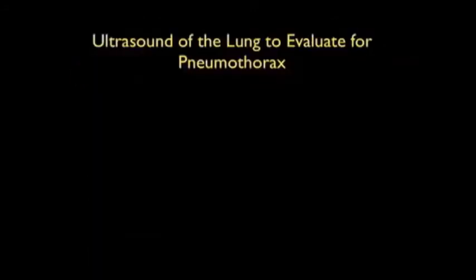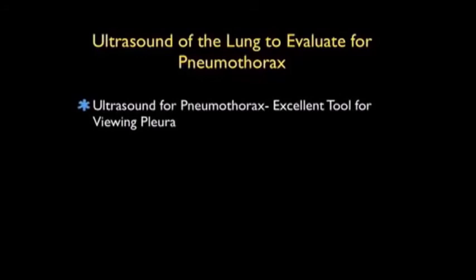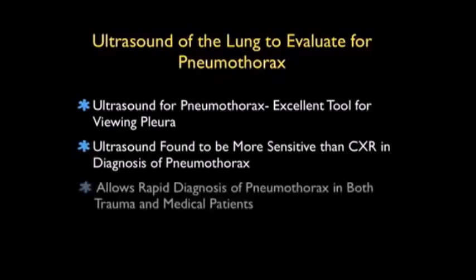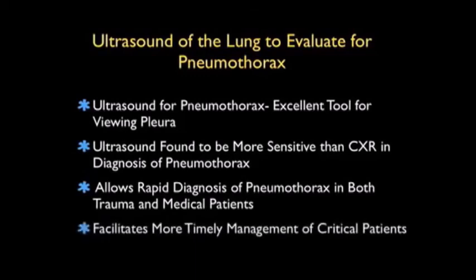In conclusion, I'm glad I could share with you this ultrasound module going over ultrasound of the lung to evaluate for pneumothorax. This is an excellent tool for viewing the pleura and making the diagnosis of pneumothorax, and there's been some research showing that it may be more sensitive than chest x-ray in the diagnosis of pneumothorax, allowing rapid diagnosis of pneumothorax in both your trauma and medical patient, thus facilitating more timely management of these most critical patients.